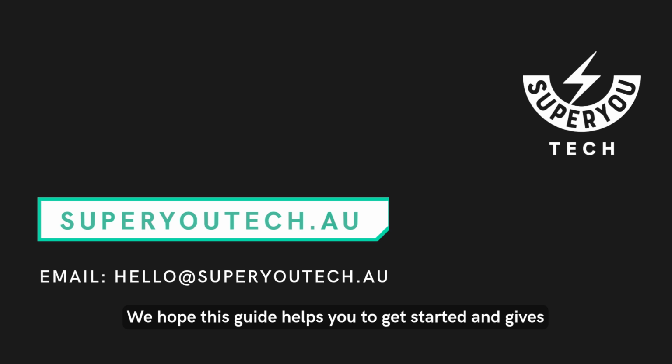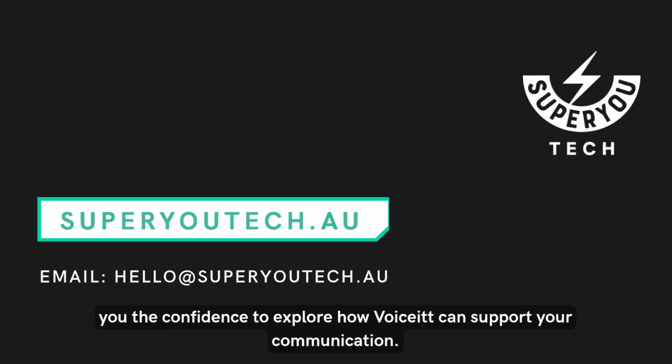We hope this guide helps you to get started and gives you the confidence to explore how Voiceitt can support your communication.